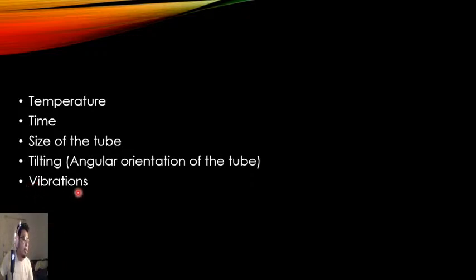When there's vibration in a particular table where you do your ESR tests, it can actually affect the true value of your results. I remember one of my professors would ask, which of the following can falsely increase the value of a patient's ESR result?